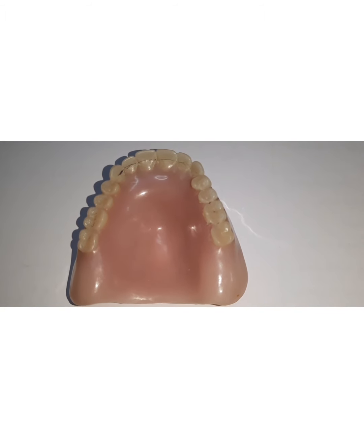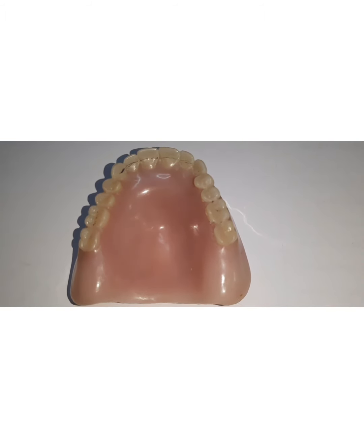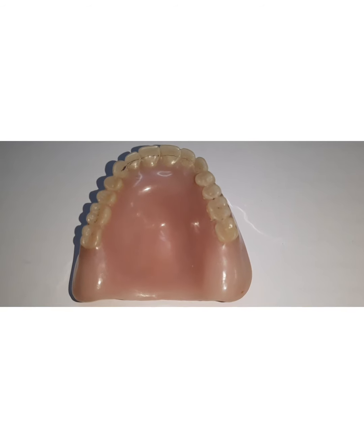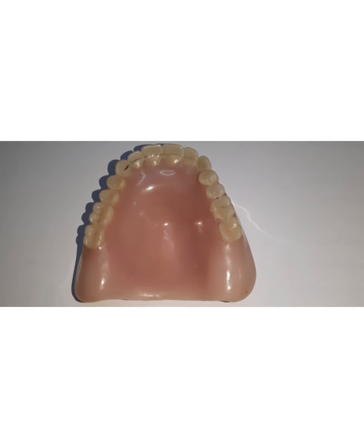Second drawback is that the wearing of acrylic denture base is much faster when you compare it with a metal denture base. And thirdly, thermal conductivity is less, and also there are chances of acrylic warpage or distortion.